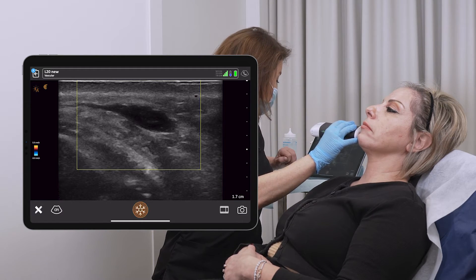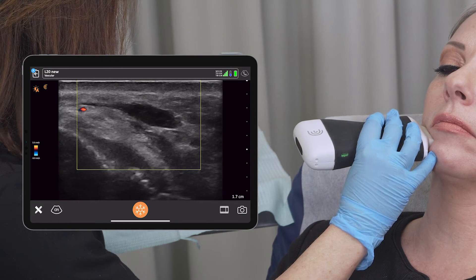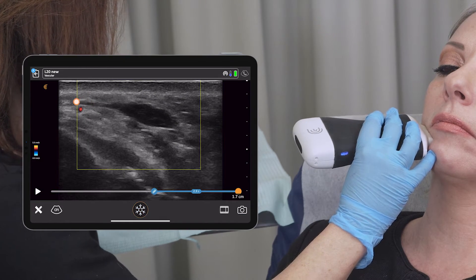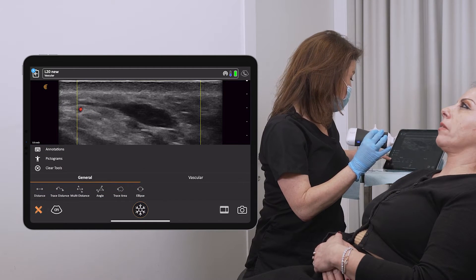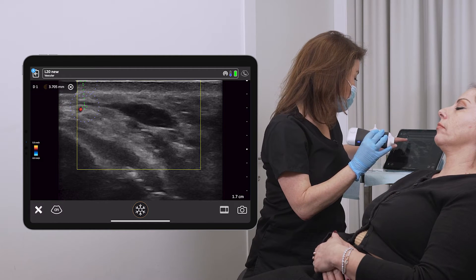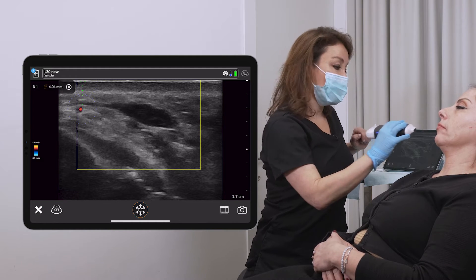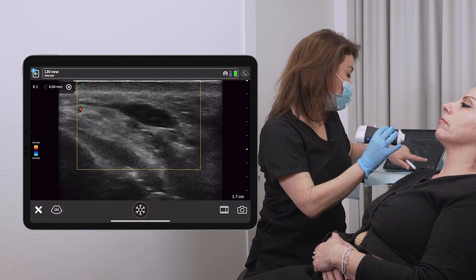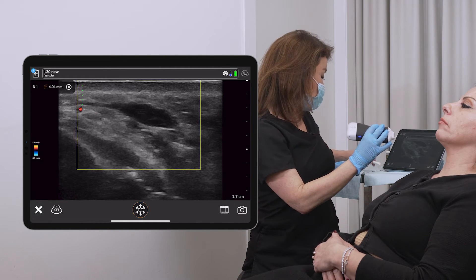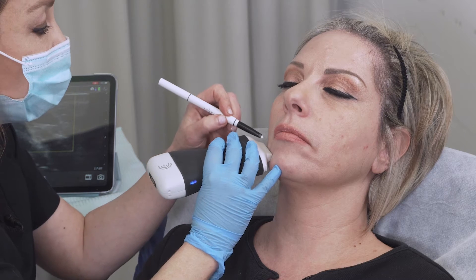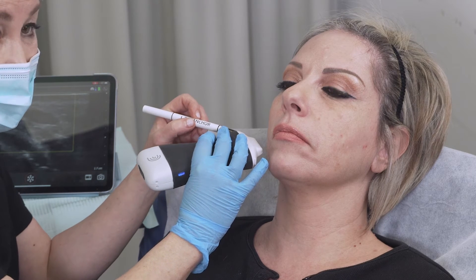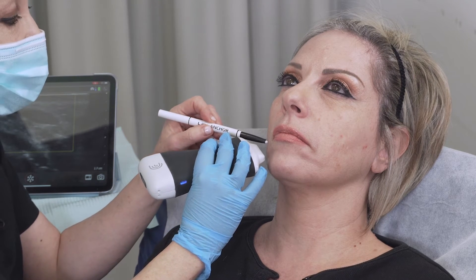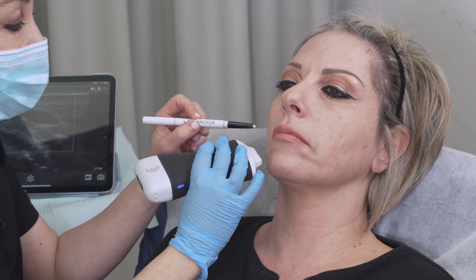I can see it right there. I'll stop and measure the distance from the top — it's around four millimeters. I'll take note of where it is: it's lateral to the marionette line, so I won't be injecting there. I'll just make a note for myself that it's there.